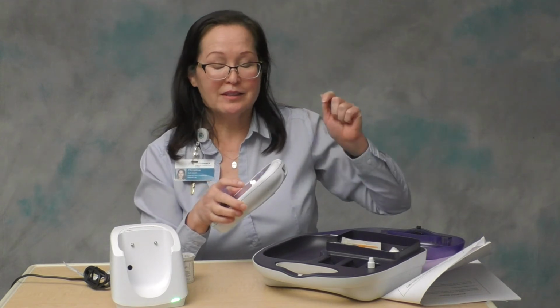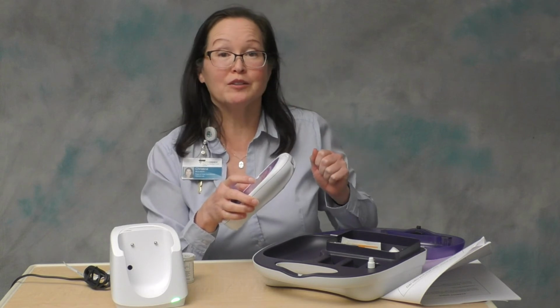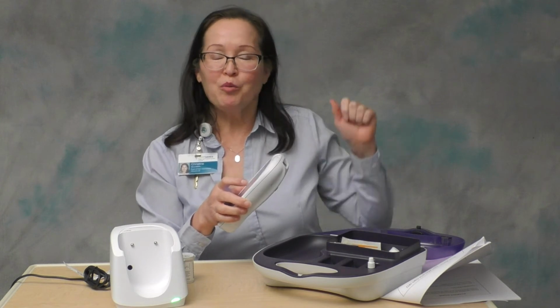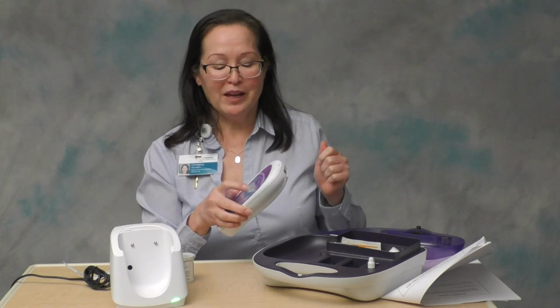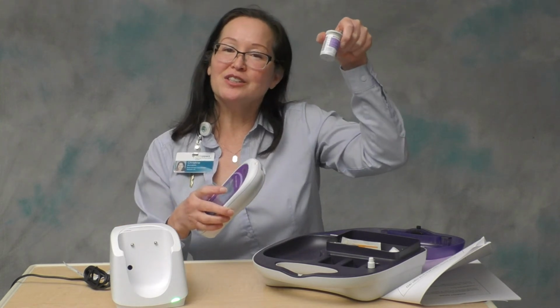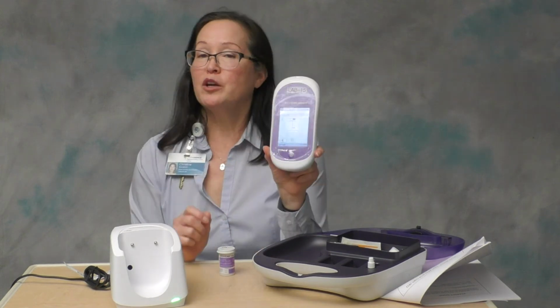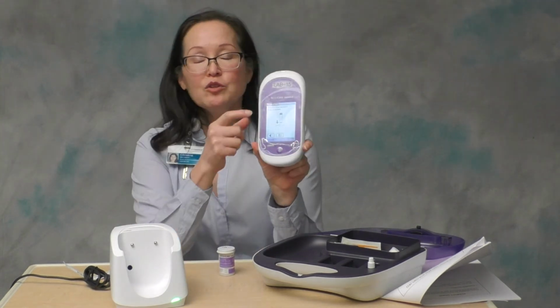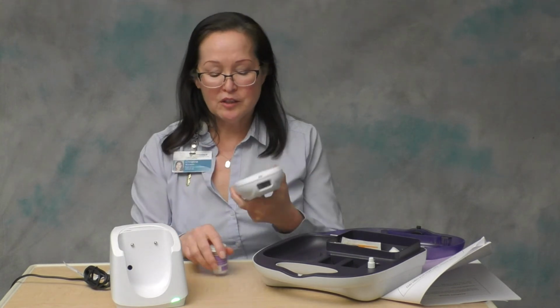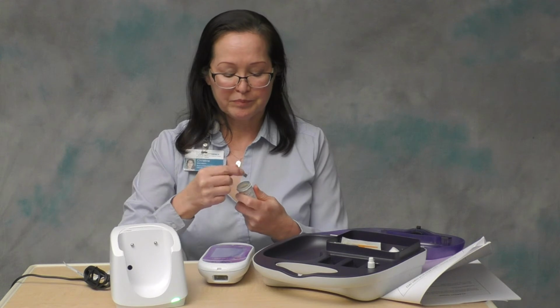I always, after I scan it, hold the bottle in my hand because I have set the bottle down before and accidentally picked up the other bottle to run QC, and then surprise, you get a QC failure. So whatever you need to do, I always keep it in my hand because it's tiny and I can still do things with that hand. Then it's going to ask you to scan the strip file. You're going to scan the strips. It has to perform a code key check. And then you'll see the icon of the strip going into the instrument. When you see that, you'll know that it's time to take your strip out.